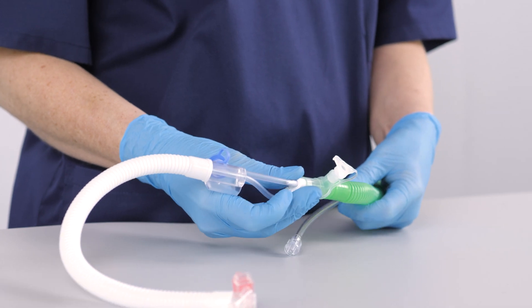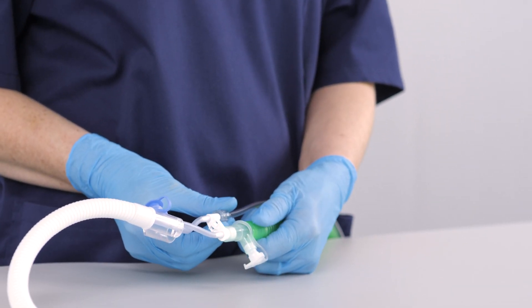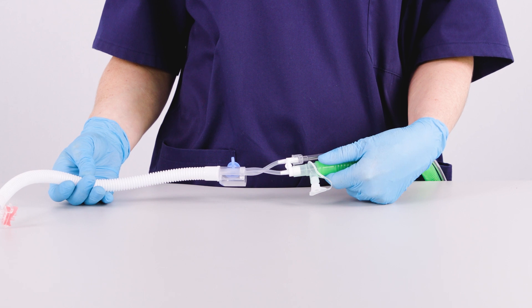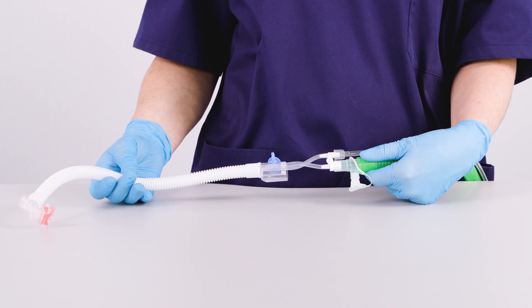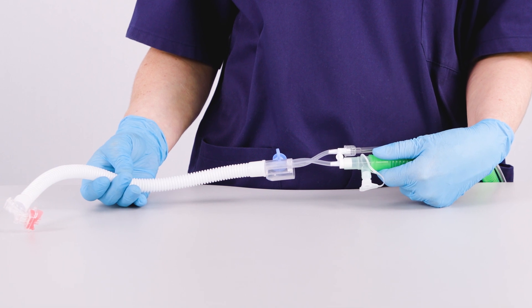Make sure that the yellow restrictor is not in place. Connect the proximal airway tube to the proximal sensor connector of the NCPAP single-limb generator. Select the appropriate NCPAP single-limb generator accessories for your patient and you are ready to use single-limb non-invasive ventilation with your SLE6000.